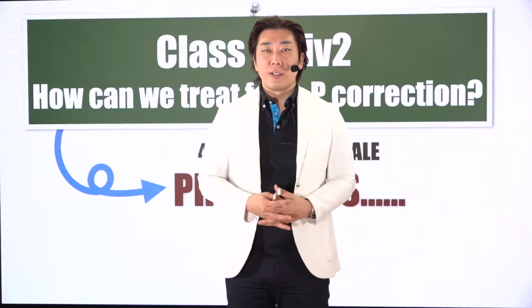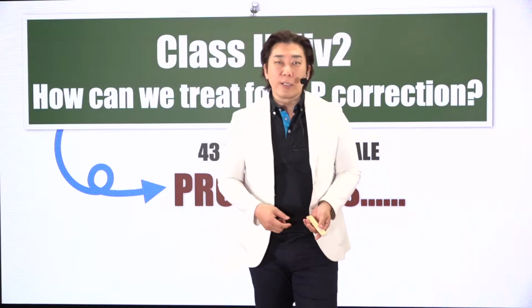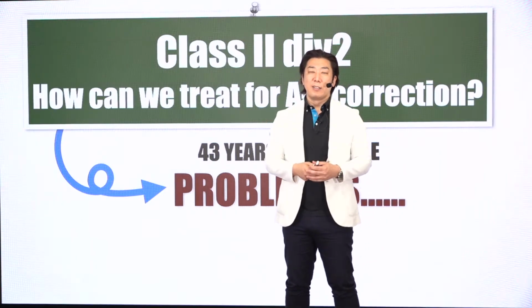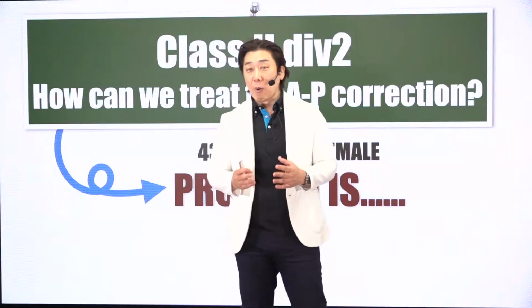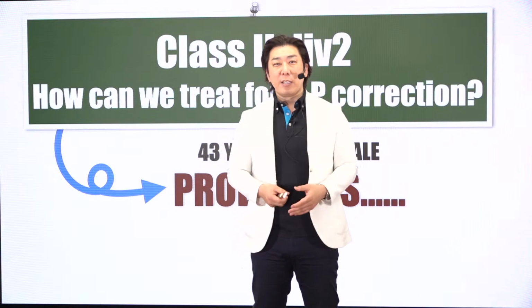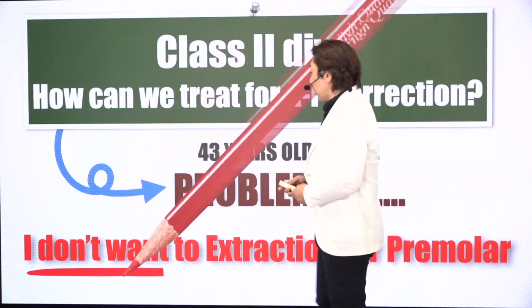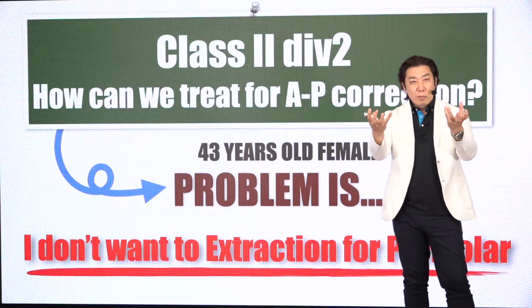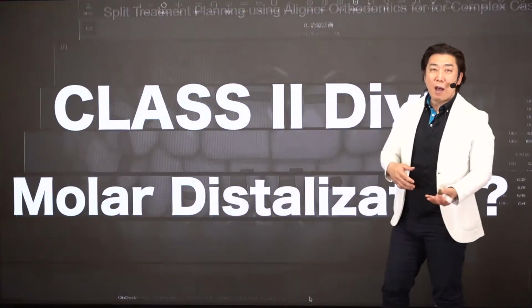But nowadays, many doctors and authors publish great articles. The Invisalign aligner has many possibilities, such as molar distalization. My mentor, my master, Dr. Barnaship from Germany, already published in the Journal of Clinical Orthodontics in 2010, an article named Invisalign Treatment Class 2 Approaching. According to this article, molar distalization is very possible with aligner treatment. Then we learn from him.